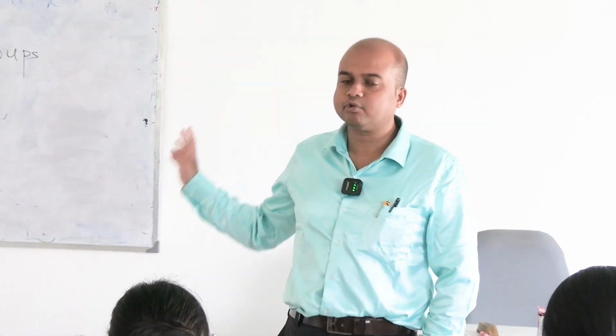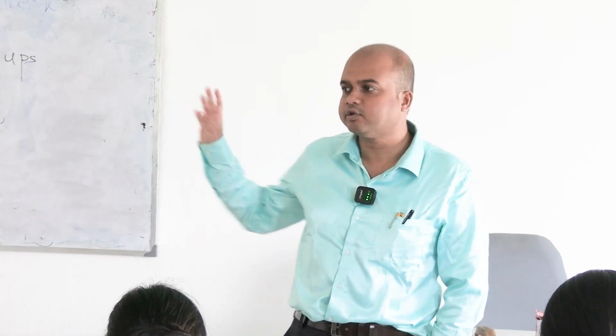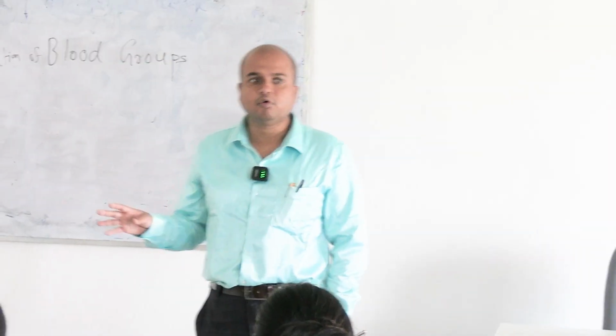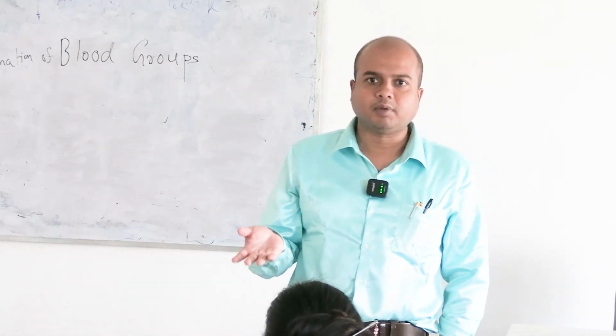You will have to show your experiment results, and then you will be asked about the theoretical aspects. In this particular session, we will not discuss the theoretical aspects. We will take it in a separate lecture session. You just need to know the preliminary things, which I think you already know from your school level, that blood groups, it was blood grouping.